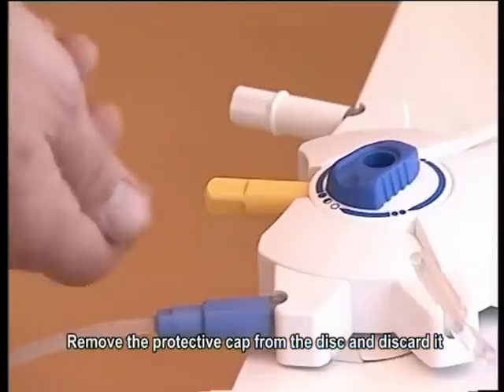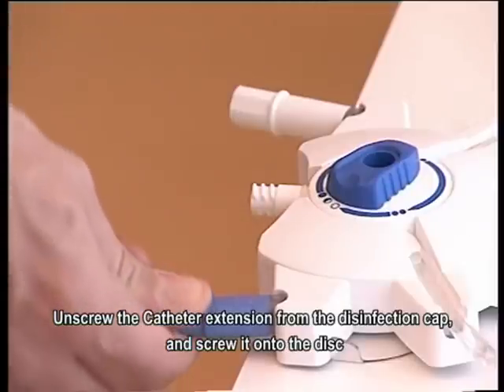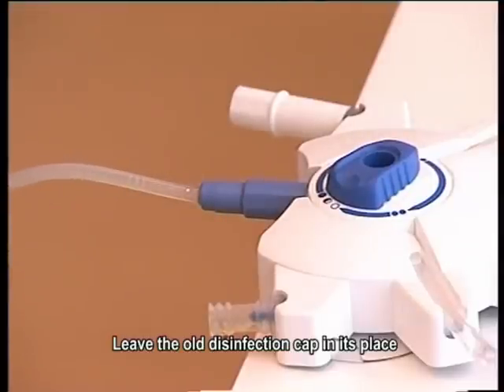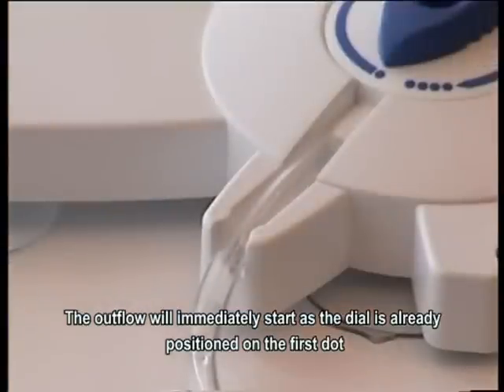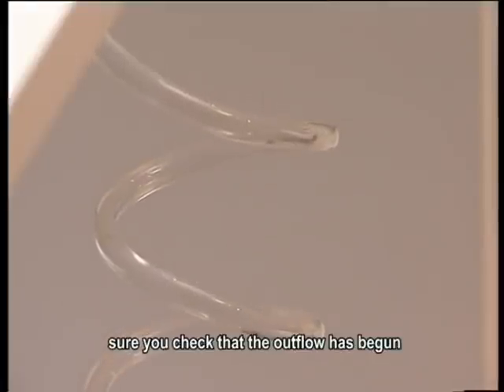Remove the protective cap from the disc and discard it. Unscrew the catheter extension from the disinfection cap and screw it onto the disc. Leave the old disinfection cap in its place. Open the clamp on your extension line. The outflow will immediately start as the dial is already positioned on the first dot. Make sure you check that the outflow has begun.